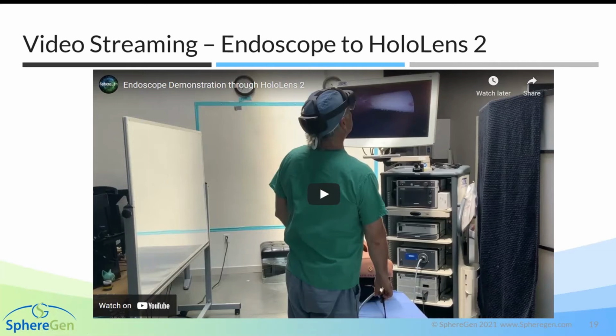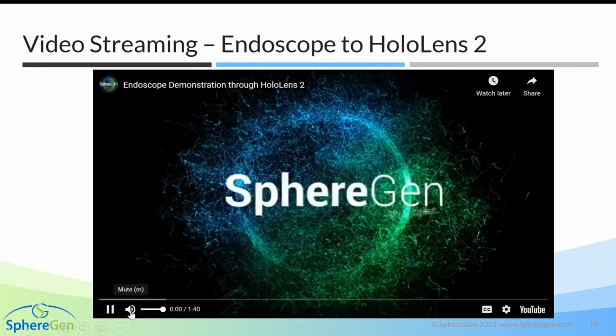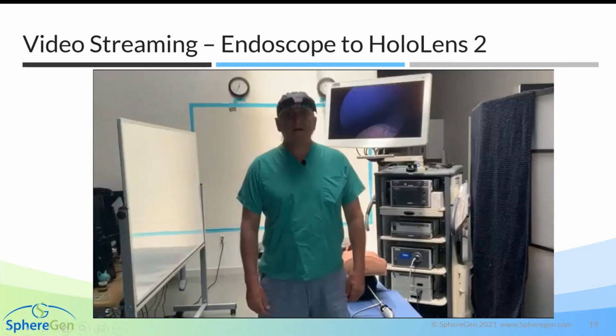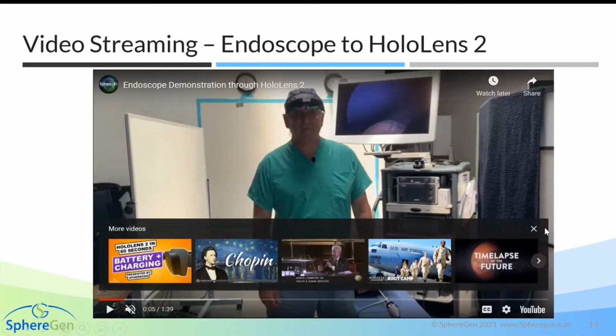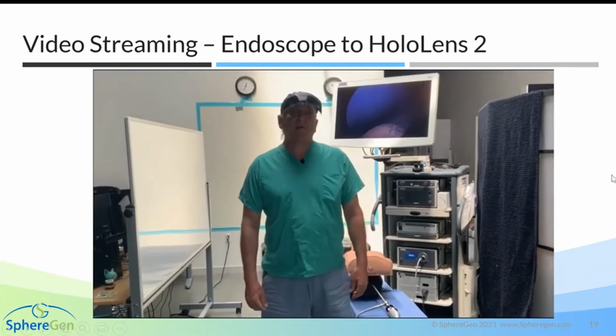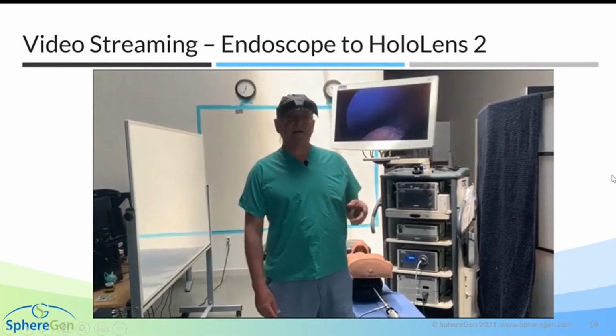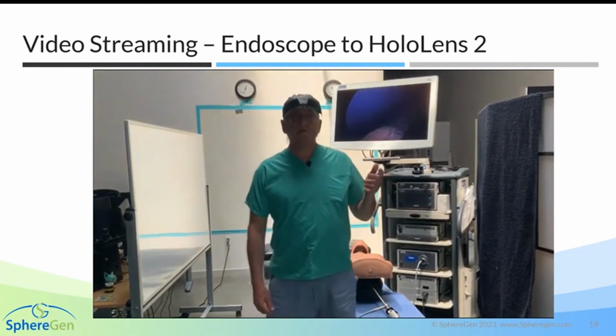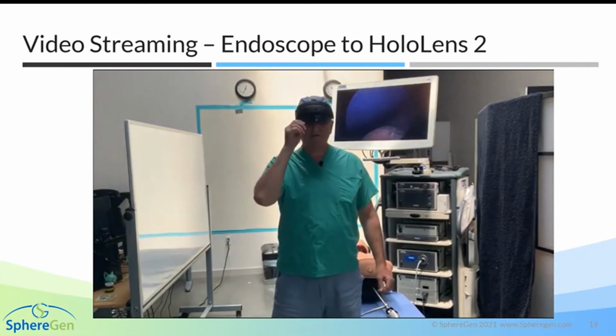Yeah, the point of this video, we were actually challenged by a company to remain nameless, that whether or not if we took a laparoscopy image, the video feed off of a laparoscope, and fed that into one of these headset devices, would it be good enough to do the surgery? Our answer is absolutely yes. And so I'm going to demonstrate here. I am speaking, but it's kind of quiet.